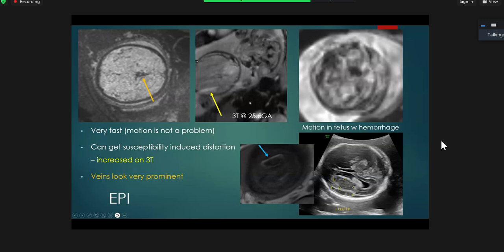So, fecal material can have higher proteinaceous and iron contents, especially if the mom is taking any sort of iron tablets or anything. Because bowel is going to be surrounding the pregnant uterus, right? So you can get susceptibility resultant from the mom's bowel loops also. Especially in the third trimester, when the head becomes more cephalic presentation, right? So that can affect imaging from that point of view.